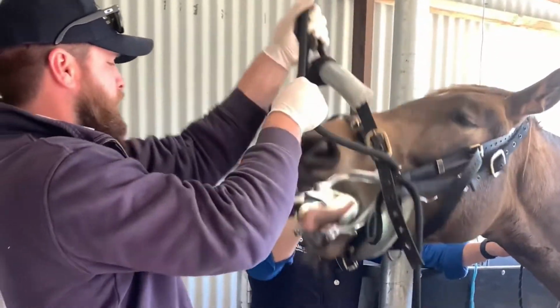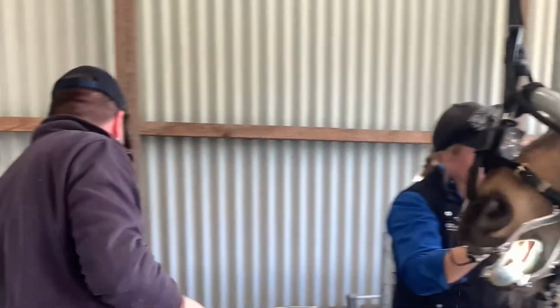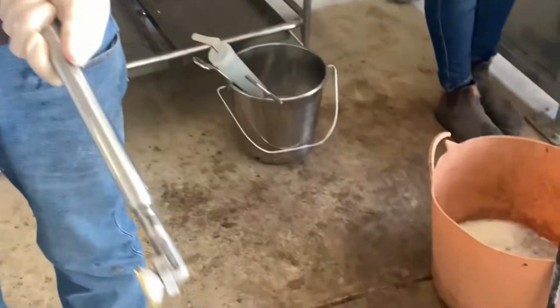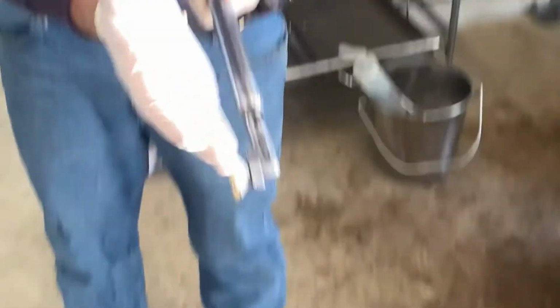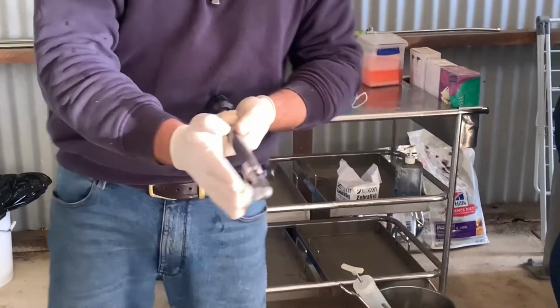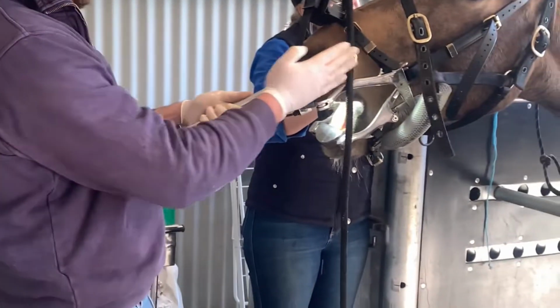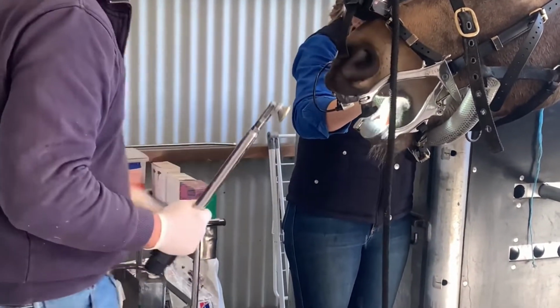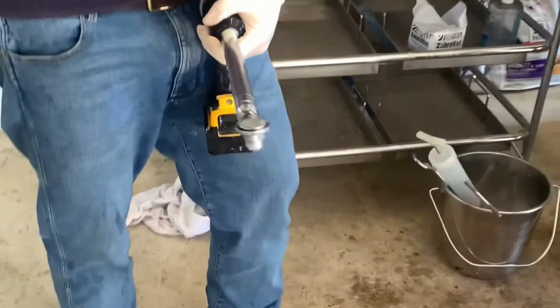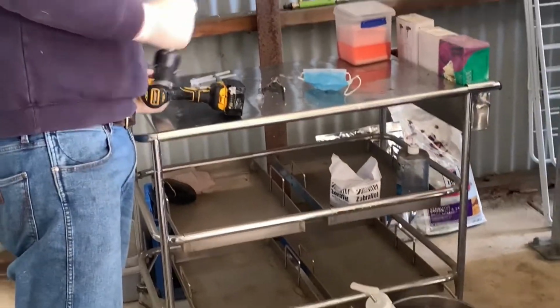I'll also show you, while we're here, the tools that we use. So this here is what we call a chamfer burr on a power float, and that'll cut on the side of the tooth at a 45 degree. It provides a nice soft tissue surface, so that when we're putting that up against the outside of the gum, that'll take off that edge. Then I use what I call the flat disc. Same thing, but that just rounds and smooths that edge for us. So we use those in order to get that.